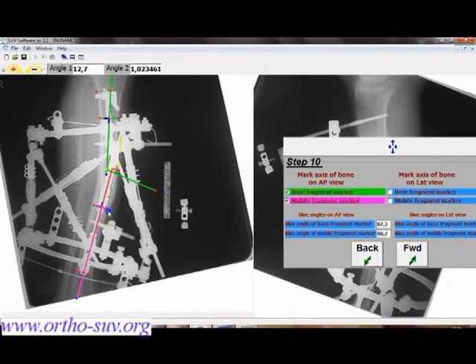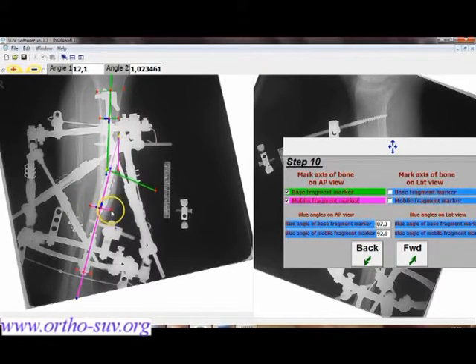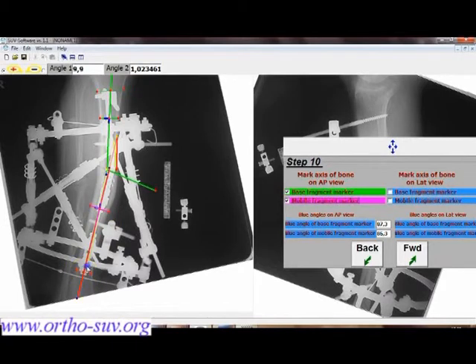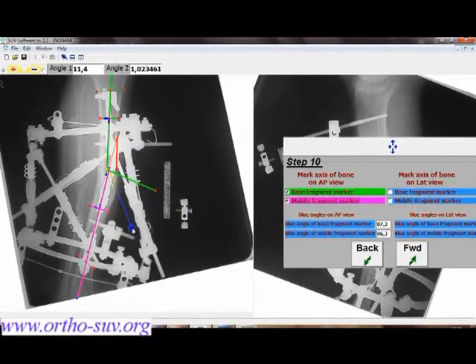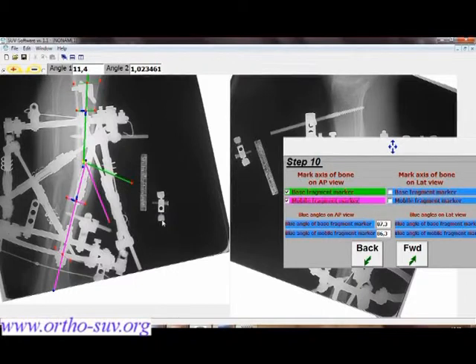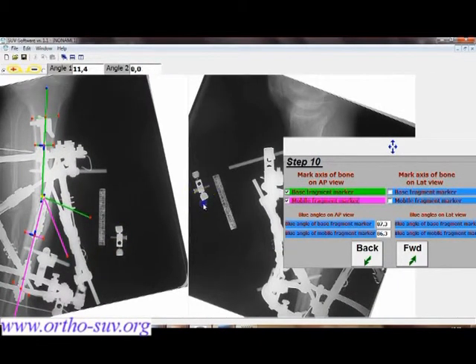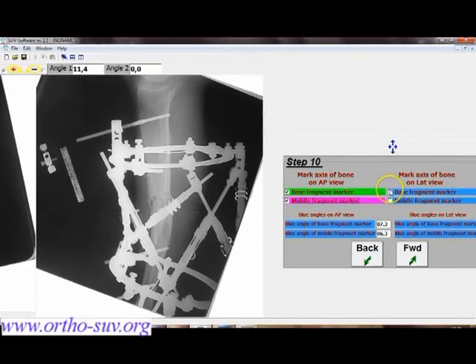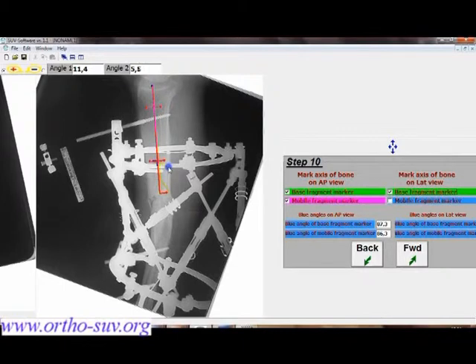Then we check the box for the mobile fragment marker and draw the pink tree from top to bottom. We align the red points of the centrators of the pink tree with the cortices of the bone — it is necessary to do this very accurately to find a precise anatomical axis of the distal bone fragment. We also align for the proximal fragment accurately. We mark the proximal border of the distal fragment with the yellow point. Since we have no gap in this case, we mark only the borders of the fragments with yellow points.